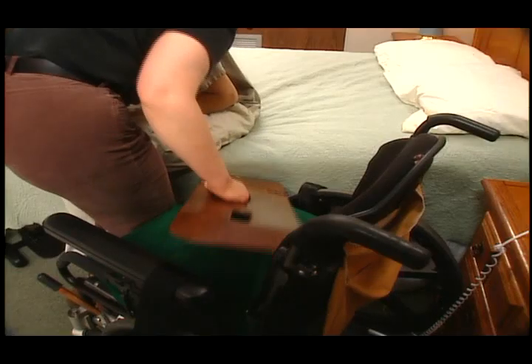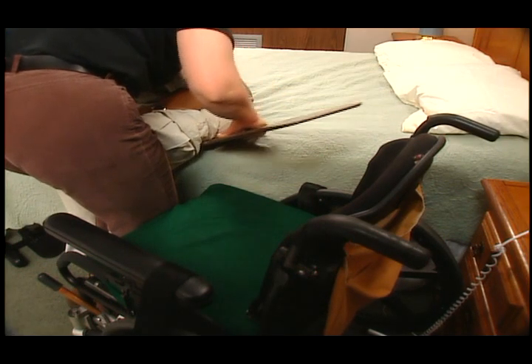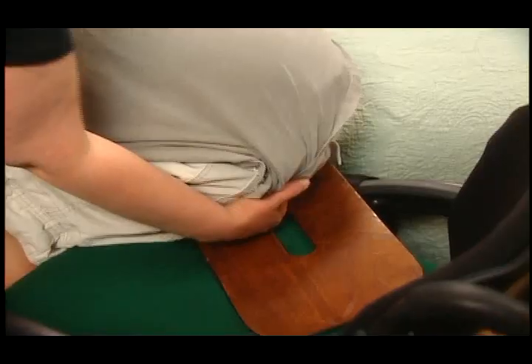As demonstrated here, a transfer board can be used to bridge the gap between transfer surfaces while performing a dependent transfer. Use of the board can increase ease and safety for both the patient and the therapist.